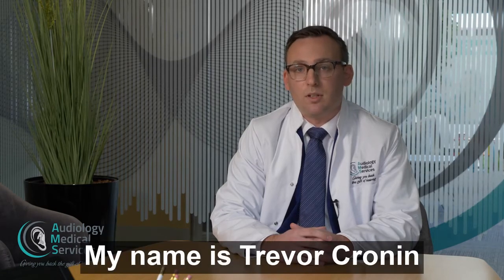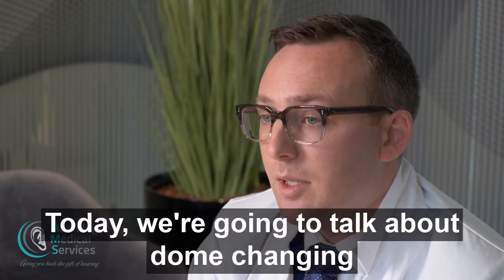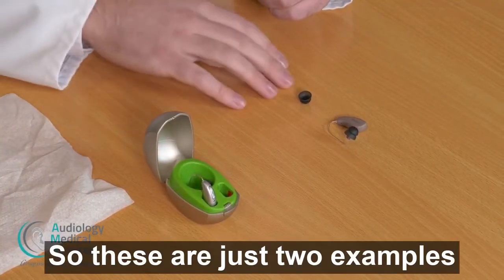Hello, my name is Trevor Cronin and I'm an audiologist with Audiology Medical Services. Today we're going to talk about dome changing. There are lots of different dome types, so these are just two examples.